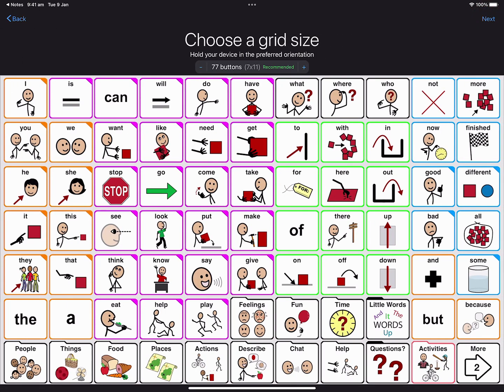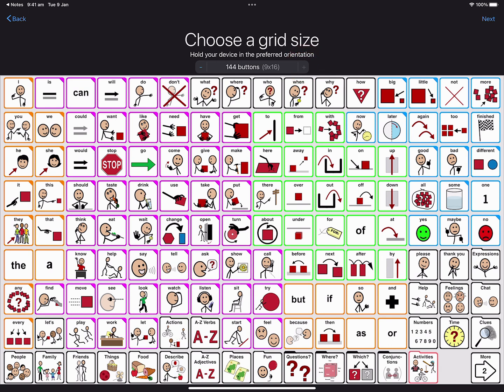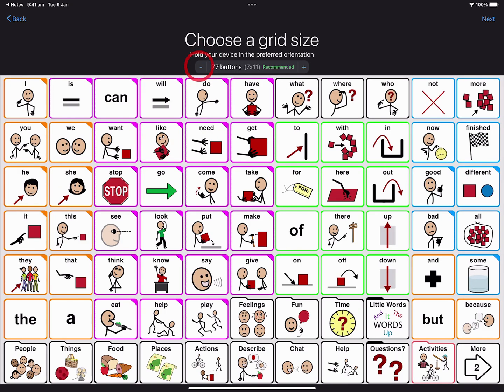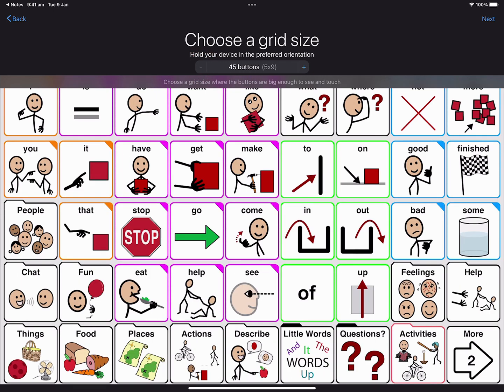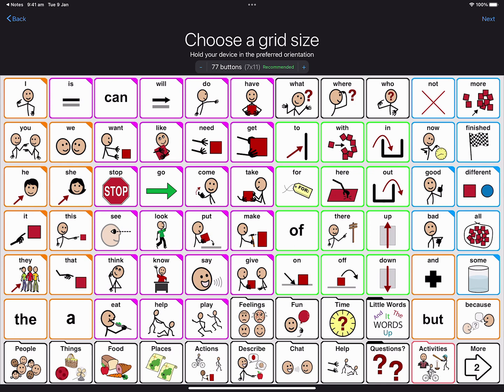Now we can choose a grid size. The grid size is how many buttons we will have on the page. We can tap the plus and minus buttons to see different grid sizes. Tapping plus adds more buttons to the page and the buttons get smaller. Tapping minus goes down so there are fewer buttons on the page and the buttons will be bigger. As a general rule of thumb, we should choose the grid size based on what the person can see and touch. Today I'm going to tap plus to the recommended grid size of 7 by 11. This adds 77 buttons to a page and gives me a great selection of words. With all these words, I will be able to say a lot. Now tap Next.